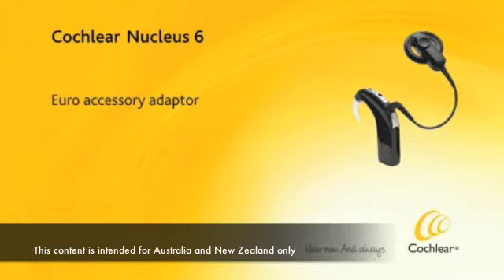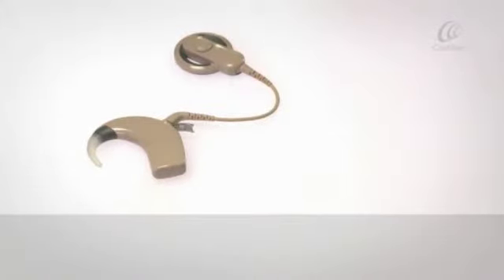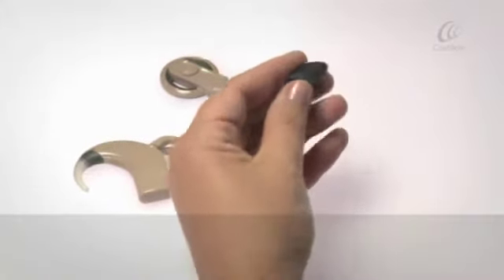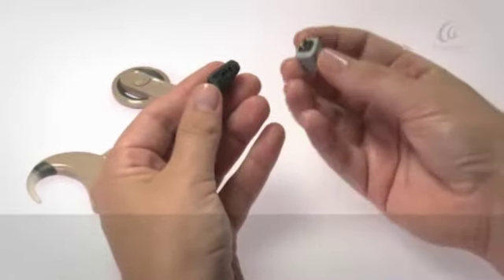Euro Accessory Adapter. Use the Euro Accessory Adapter to connect an FM device with a 3-pin Euro plug into your CP910 sound processor.